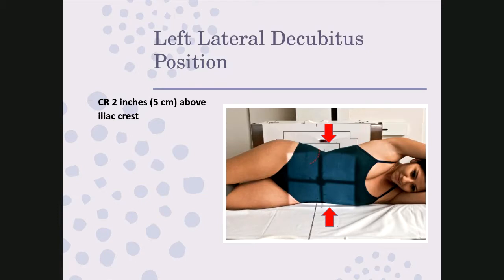And notice that it says that if you're going to do decubitus, the patient has to be on their side a minimum of 5 minutes before the exposure. So minimally 5 minutes lying on their side to allow all the air and the fluid to layer out. If able to, 10 to 20 minutes is preferred. If that is not possible, though, to wait that time frame, then 5 minutes would allow the air to rise and any abnormal fluids to accumulate or fall.